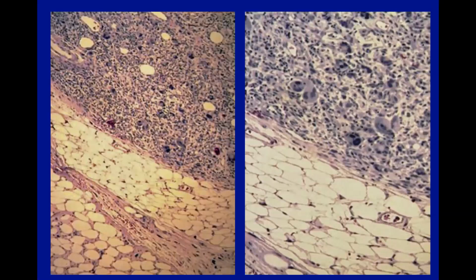So just to show you the histology. This is kind of classic dedifferentiated liposarcoma. When you see this, there is no need to do any MDM2 FISH testing, right? I mean, over on the left-hand corner, you've got classic low-grade liposarcoma. You can even see the scattered atypical stromal cells, the increased amount of non-fatty tissue, and it's juxtaposed very sharply to a higher-grade pleomorphic spindle cell sarcoma.